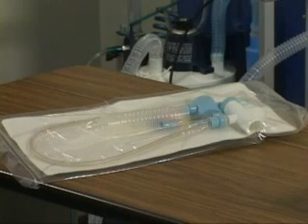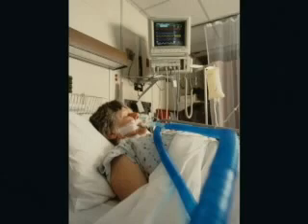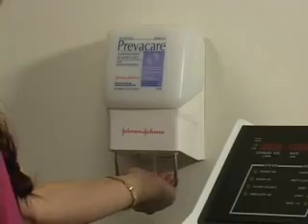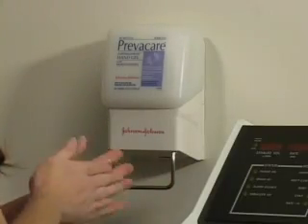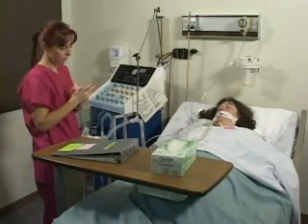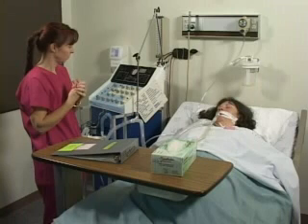When suctioning is required for a client with an endotracheal tube on the ventilator, the general practice is to use an inline suction catheter. These are especially helpful for clients who require positive end expiratory pressure, usually referred to as PEEP. Opening the system would create a loss in positive pressure on the alveoli. Suctioning is a sterile procedure. Although the inline suction catheter is a closed system, hands should be cleansed prior to any client procedures. In this case, use of an alcohol-based rub is as satisfactory as using soap and water.